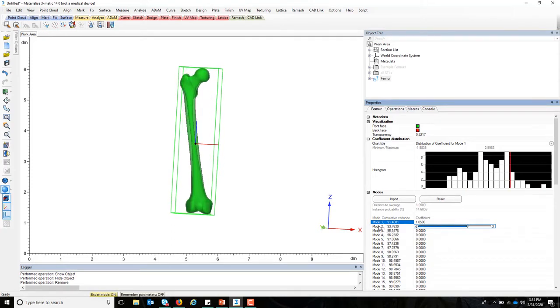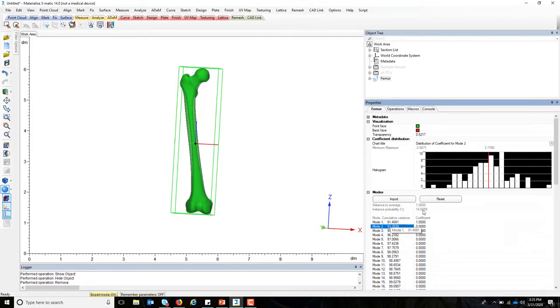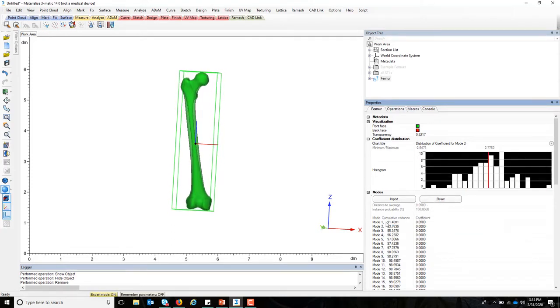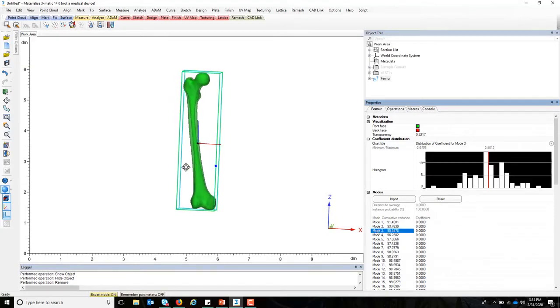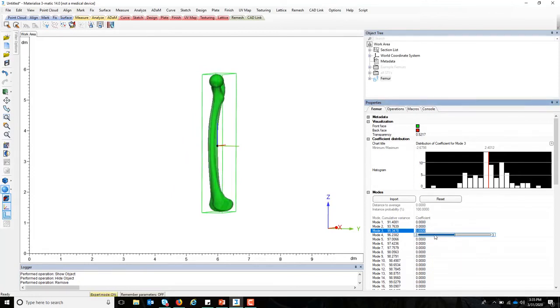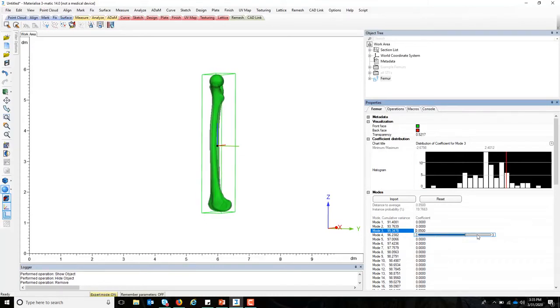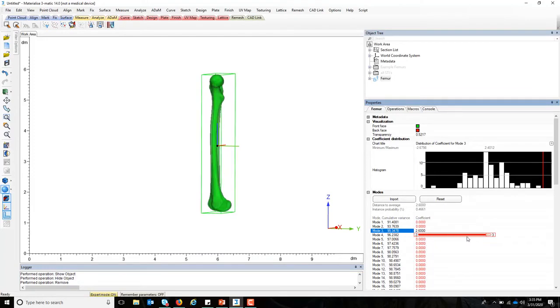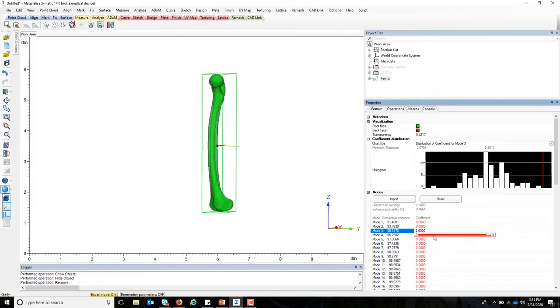But it's important to realize that there's multiple modes in this project. And so if you look at something like mode 3, for example, what you might start to notice is that not just the shape or the general size is changing, but the curvature of the bone is changing. And so through a series of statistical shape modeling algorithms, we're able to understand and tease out what actually is changing.